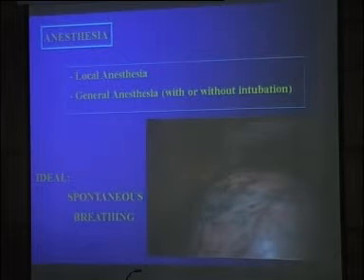You can perform thoracoscopy under local anesthesia, I mean local lidocaine on the skin, neuroleptic analgesia, intubated patient, tracheal intubation, or under general anesthesia with or without intubation too, laryngeal mask, whatever you want. It's not a big deal. It depends on your facility, on your colleague anesthesiologists, etc. I think the first take-home message is to try to keep the patient in spontaneous breathing. It's very, very important. Because in a ventilated patient, you will be bothered by the re-expansion of the lung. And it's much easier to perform thoracoscopy in a patient with spontaneous respiration. Okay? It's the first message.